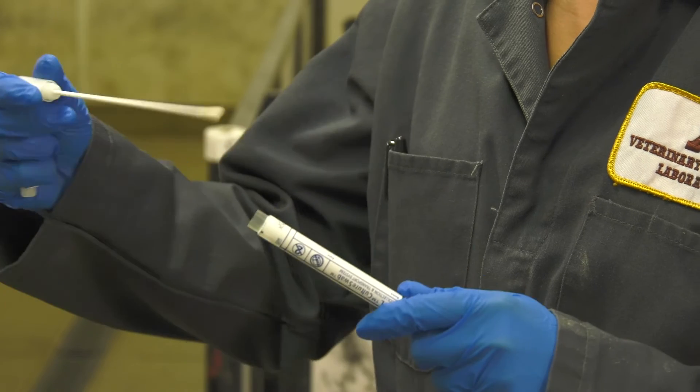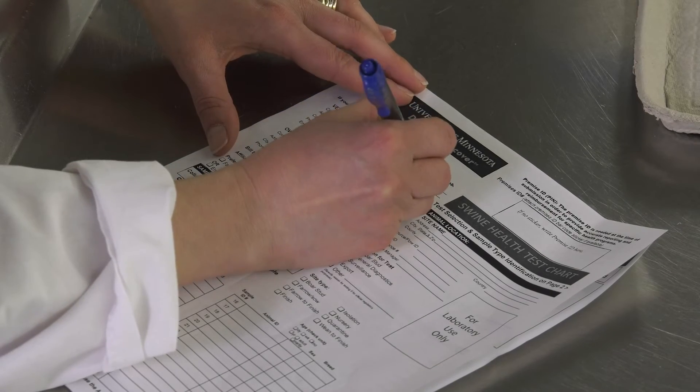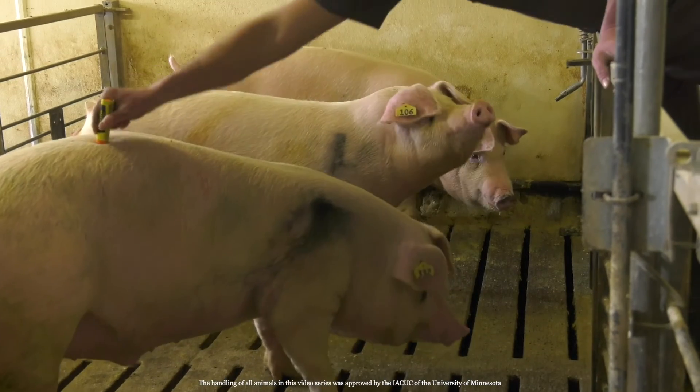Place the swab in the tube and properly label it before placing in a labeled bag. Avoid a tube with a gel medium as it may interfere with testing. Fill out the submission form for that pig sample. Mark the pig as sampled.